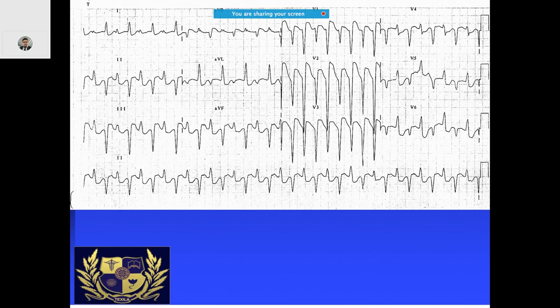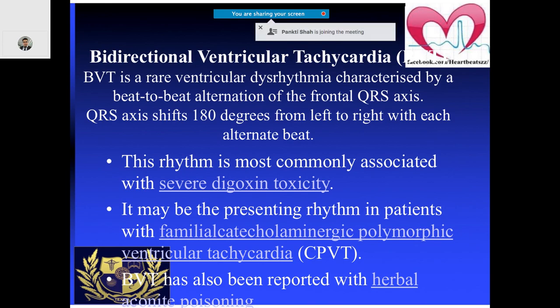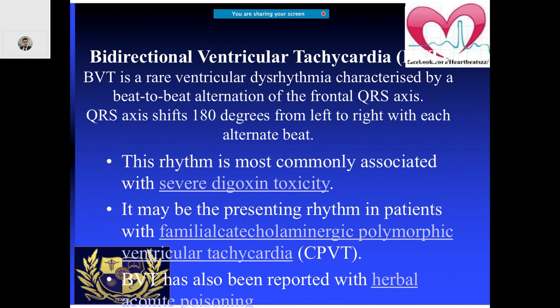In this ECG, the axis is changing with each alternate beat, and there is a QS wave from V1 to V4 with a left bundle branch block pattern. When the QRS axis is changing like this, it is characteristic of bidirectional ventricular tachycardia. This is mostly seen with digoxin toxicity and also in patients with familial catecholaminergic polymorphic VT.